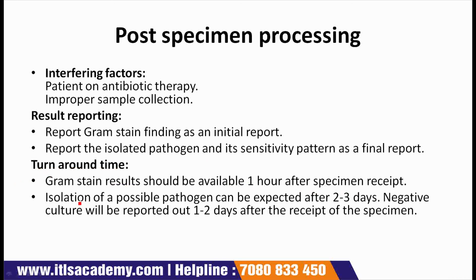Next is isolation of a possible pathogen can be expected after 2 to 3 days. Negative culture will be reported out 1 to 2 days after the receipt of the specimen.